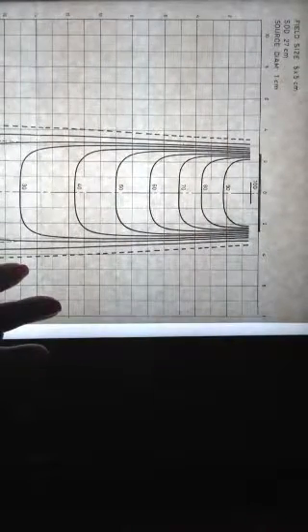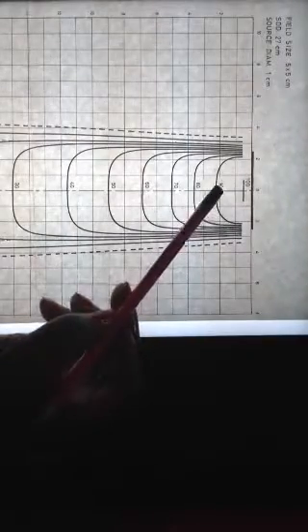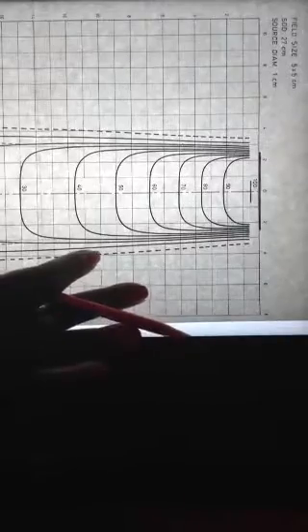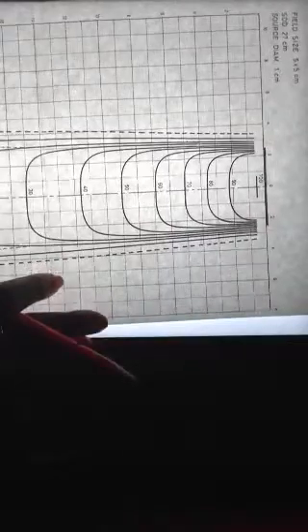irradiating a water phantom, which is flat. We put the isocenter at the top of the water in the phantom, and then various measuring devices along the central ray and across the beam. Then we take dose measurements and connect points of equal dose along the beam and across the beam. Each of these lines represents a percentage of dose, but again, this represents what radiation looks like on a flat water phantom.